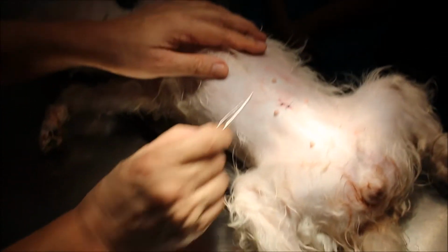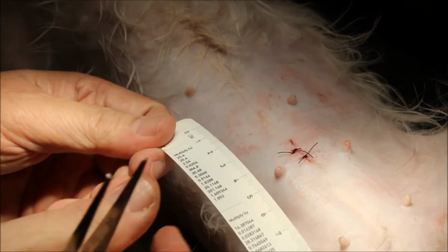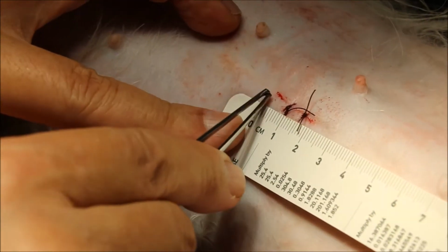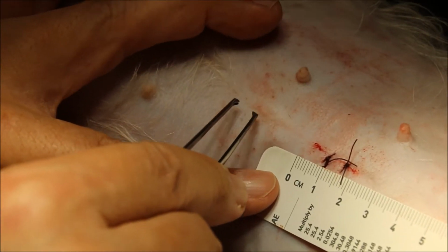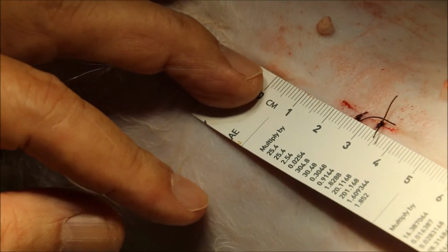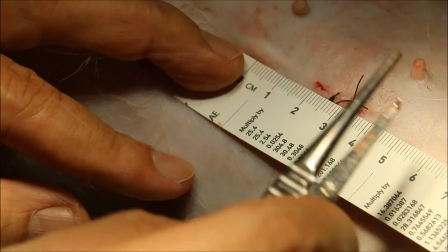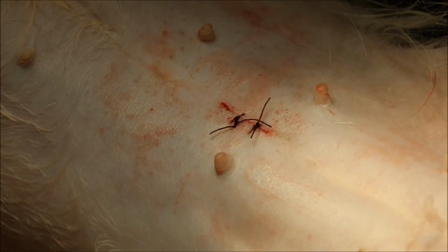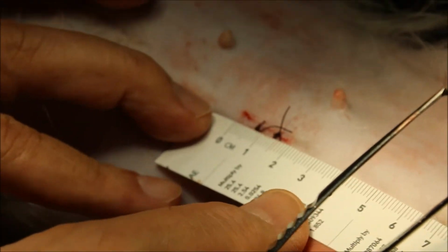So I just want to explain that to get the smaller skin incision, which the owner is most happy with, you really need to get this distance, the start of the incision to the umbilical scar. Umbilical scar is around here. I don't think you can see, but some of them is more obvious. So it's about 2 centimeter. So you don't go 1 centimeter, because then you can't reach the uterine horn, uterine body. It's too short. Too long, too far away, you cannot get the ovaries.